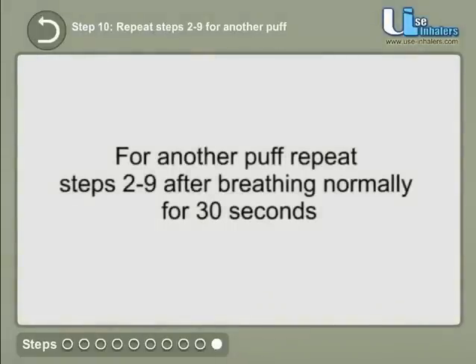For another puff, repeat steps 2 to 9 after breathing normally for 30 seconds. Hold your breath for 5 seconds.